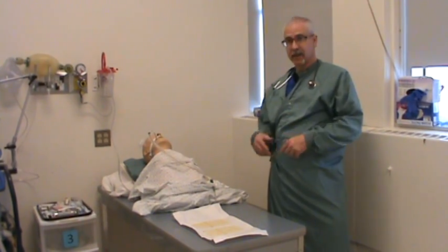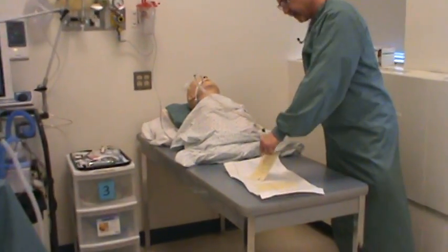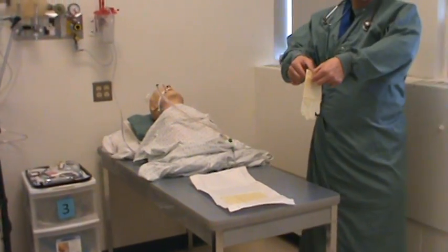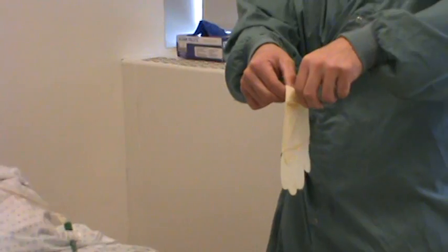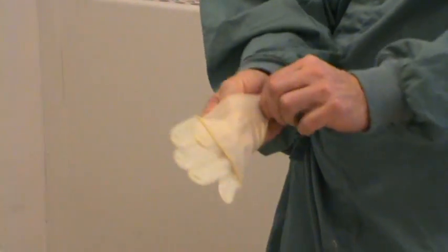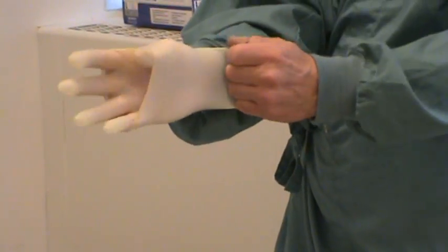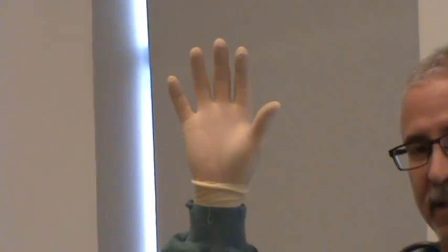So how do I get sterile gloves onto my clean, thoroughly dried hands? This is how. First, I'm going to take this portion here and pick up my right glove. All this that is bent back onto the sterile glove will not come into contact with the glove — it's going to come into contact with my skin. I'm going to take my hand, line it up with the position of the glove, and pull this on like so. This glove is sterile.